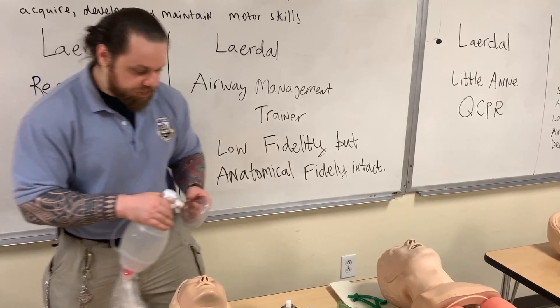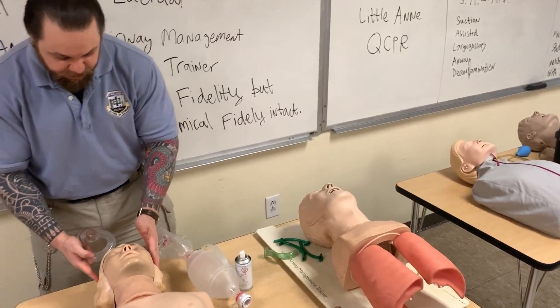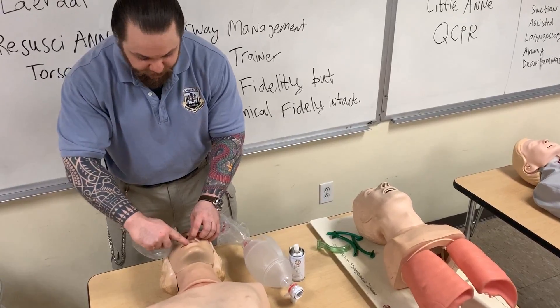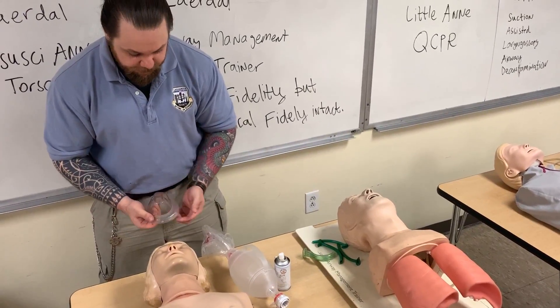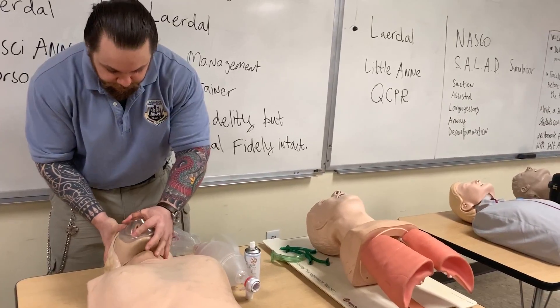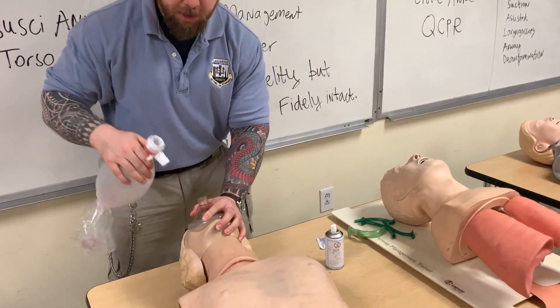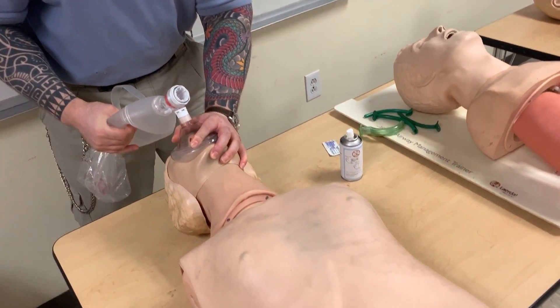I want to show you how I teach students in terms of ventilation. This mannequin does not accept any type of adjunct — you cannot place an OPA or NPA. The Airway Management Trainer, however, can. So what I do is I stretch my cuffs, place it on the patient's nasal bridge, then extend the head over the atlantooccipital joint, connect my BVM, and ventilate. And now we see chest rise.